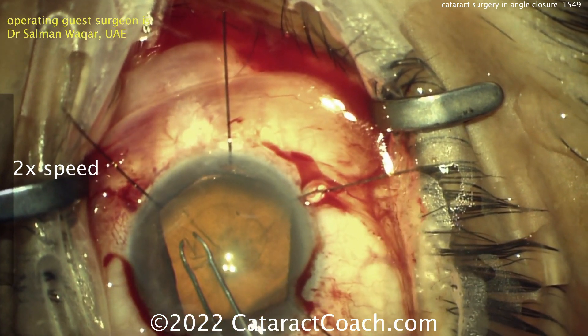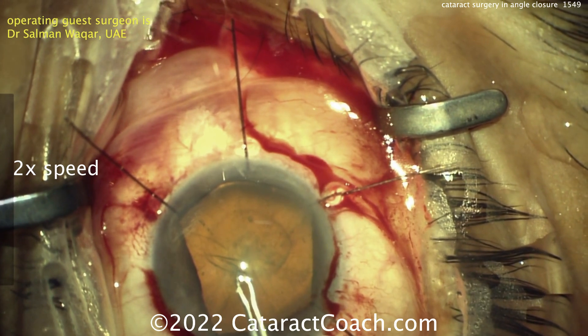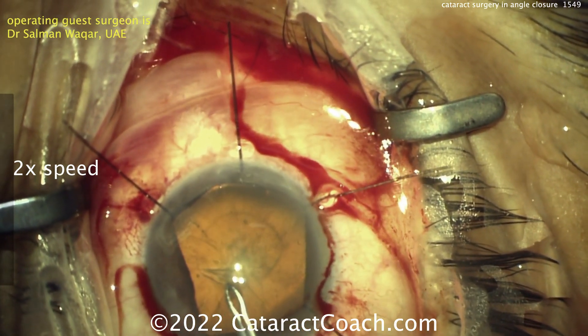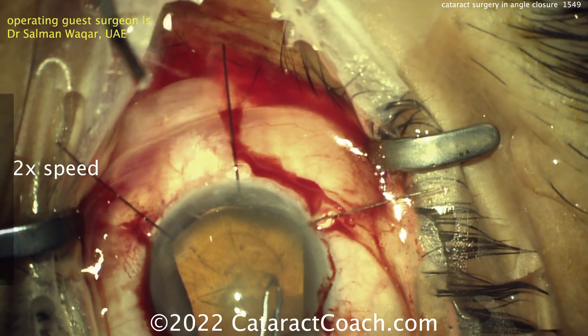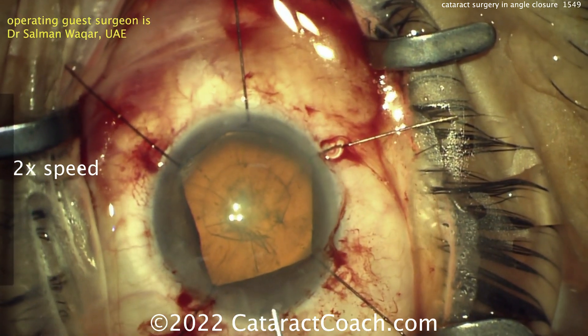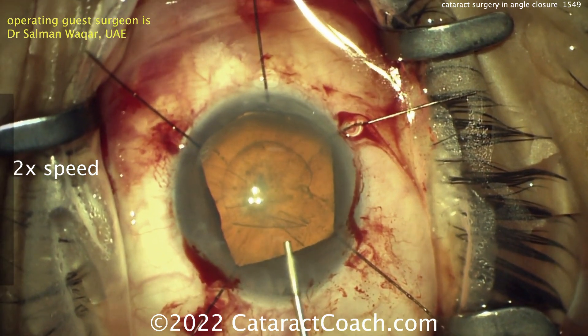You could also do — and we've shown this before — a pars plana partial or brief anterior vitrectomy to help create some room. Just be careful: if it's a tiny eye or nanophthalmic eye, you've got to ask yourself where is that pars plana — could be unusual anatomy. It's important here to get this rhexis done; refill with viscoelastic as many times as you need to. There's no issue there. Take your time.